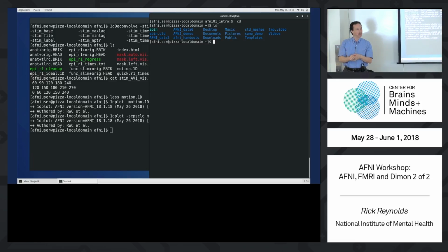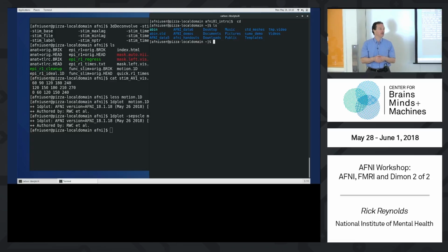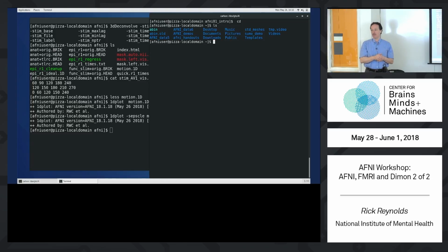No, PAR-REC is Philips. Oh, Philips. But they have their own structure, which is something a little bit like PAR-REC. With the raw data, and then we save it, like we write it as NIFTI. Oh, good. From the scanner. It automatically generates the header file and has all the scan information. Okay. Is it all animal studies? Are you using it for animal studies? Yeah. Rats and marmosets.